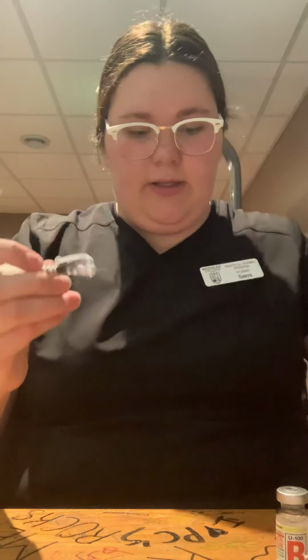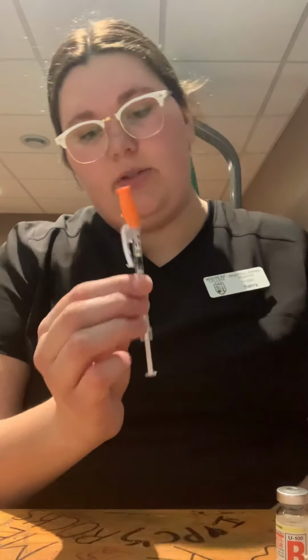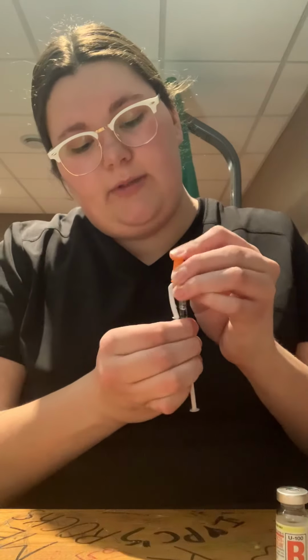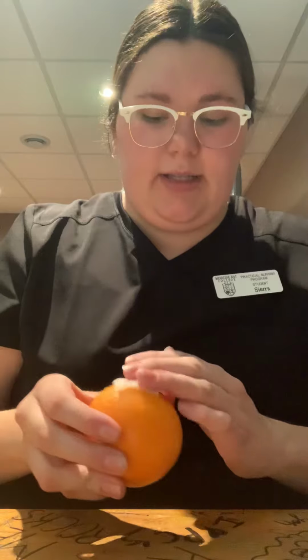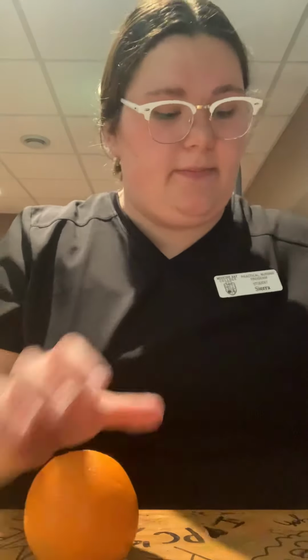Straight out. Now we're going to one-hand scoop our lid so we're not contaminating. And we will put the lid back on and let this sit for a second while we prep our patient. So we need to clean our injection site on the patient. So the orange, I'll just clean the patient and let this air dry.